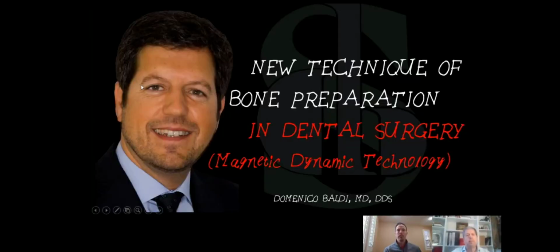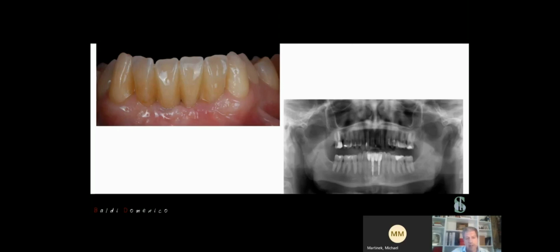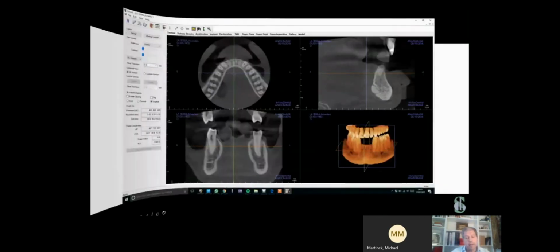Now we are going to speak about the new technique of bone preparation in dental surgery. I mean, the new instrument, magnetodynamic technology. So nowadays, when we start to work on our patients, fundamentally, we are looking to be less invasive. And as I want to show you in these cases, we try to be less invasive using the latest technology. Like this, we start from this situation and we arrive at this situation, a good result from an aesthetical point of view and a surgical point of view, using guided surgery.